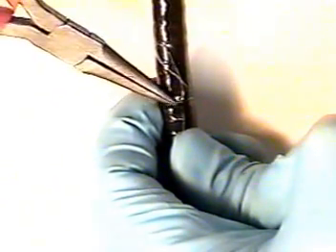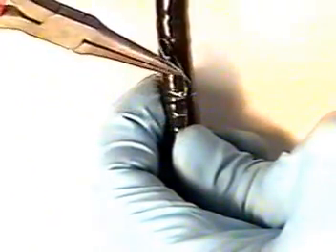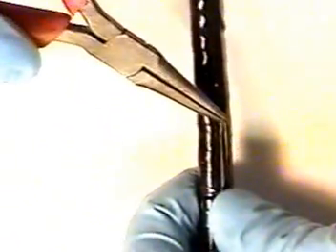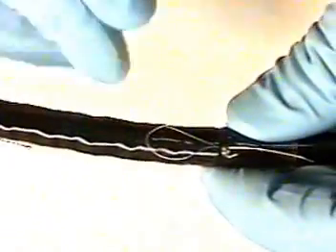Now the binding has pulled through the 3 or 4 turns. The thread which is run down the scope will stay out the back of your thumb, which should be like this. Your loop is now pointing towards the distal end of the instrument. Now we can proceed to bind at least another 3 to 4 turns.